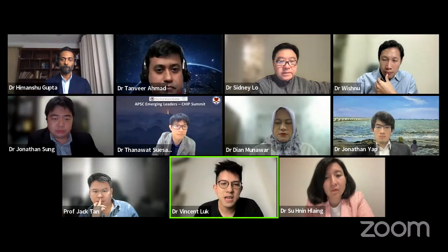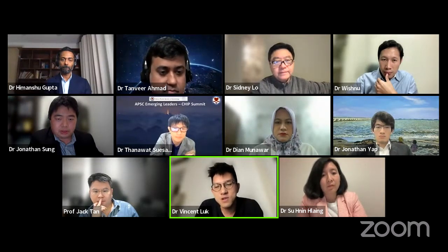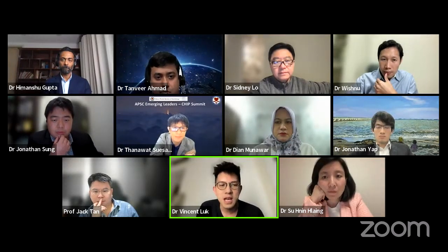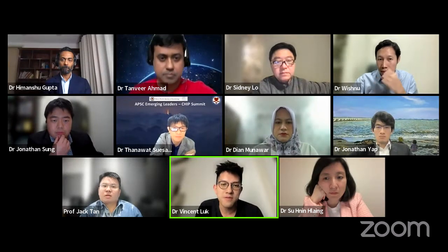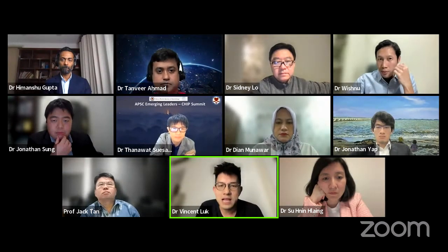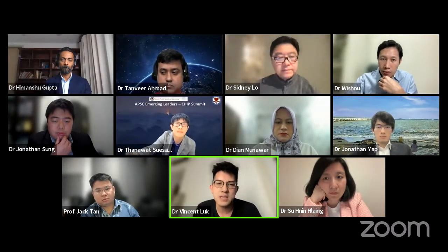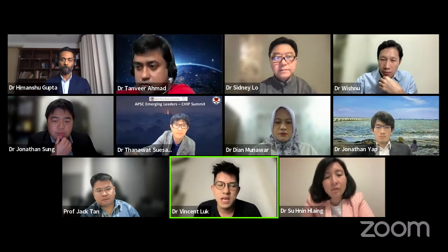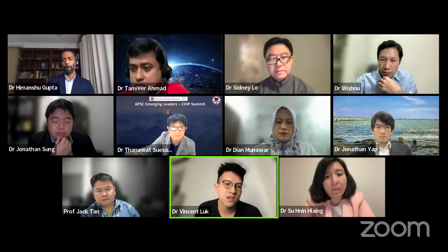Yeah, for sure. I think your approach is totally practical. When the balloon opens, then you're sure that the stent will open. But sometimes, if the balloon causes really bad dissection, it will limit our next step. Should we upsize the burr? Should we have a high pressure balloon? And of course, when there's a massive crack, we know there's always a chance of dissection.